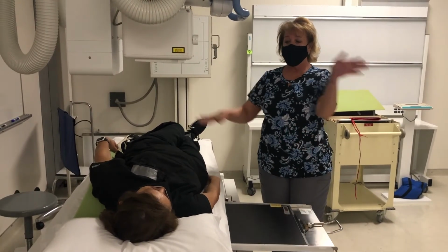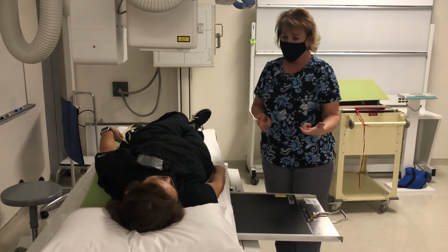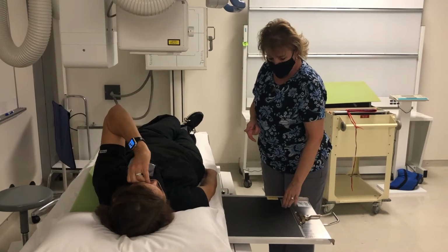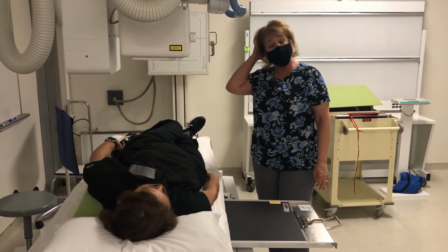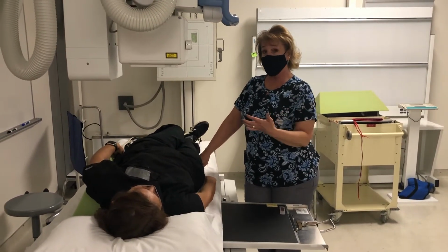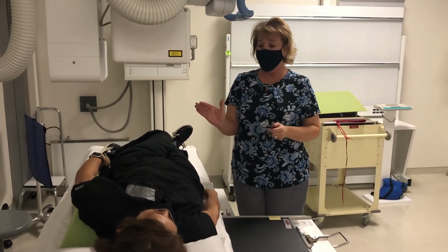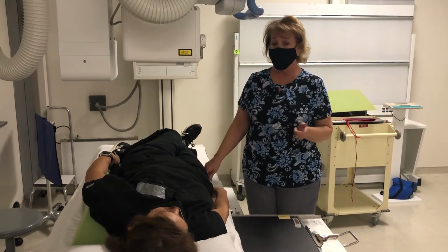Take the sponge out, have her roll LPO, do the second oblique at 20 minutes, and then probably wait another 10 minutes and then do a 30-minute KUB, and by then most of the contrast will have been processed through her kidneys, down her ureters, and should be collected now almost completely in her bladder.